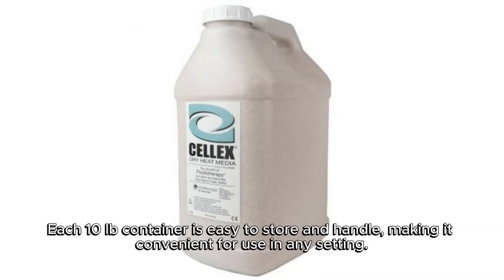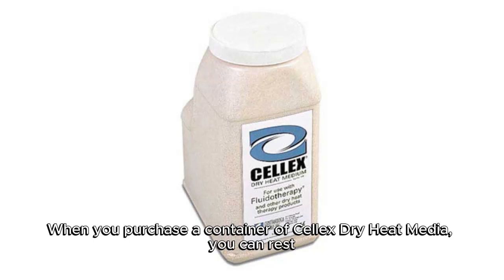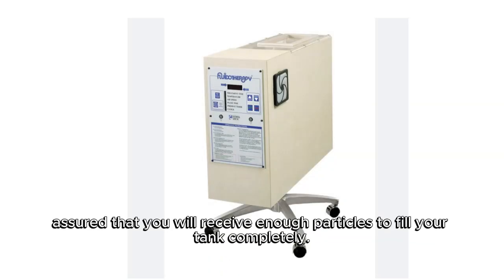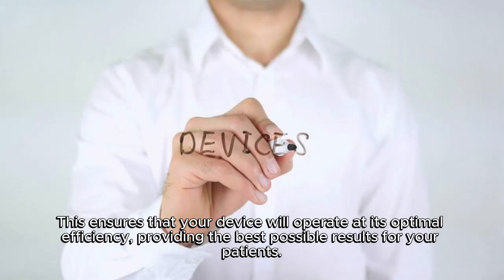Each 10LB container is easy to store and handle, making it convenient for use in any setting. When you purchase a container of Selex Dry Heat Media, you can rest assured that you will receive enough particles to fill your tank completely. This ensures that your device will operate at its optimal efficiency, providing the best possible results for your patients.